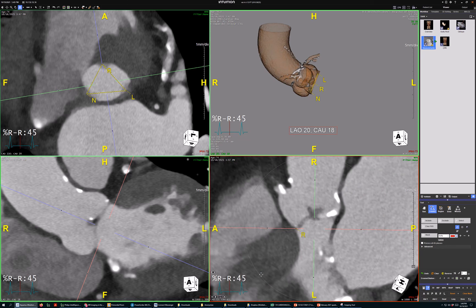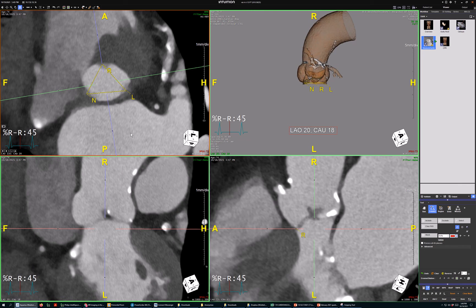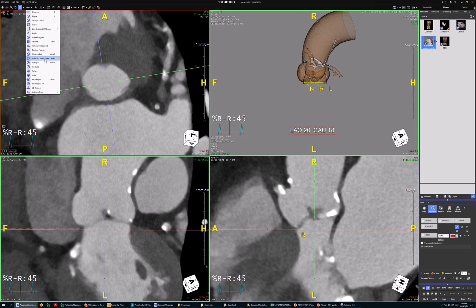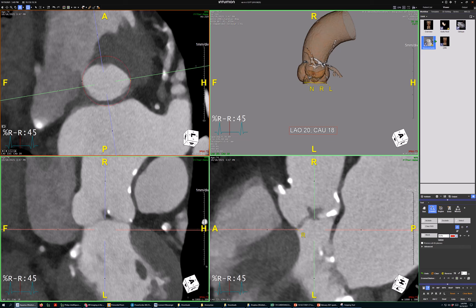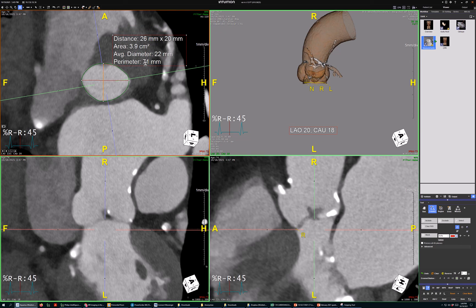From here, rotate so it's easy to make the next couple measurements. Roll this down a little bit until we're below the virtual basal ring and left ventricular outflow tract. Come here, get this assisted line pair tool and do that, then hold down the shift button to edit this line — just a left mouse hold. We don't want any concavities; that's a little bit of leaflet tissue coming into the lumen. That's right in the middle of two different valves, so that looks good. Take this picture. Capture.